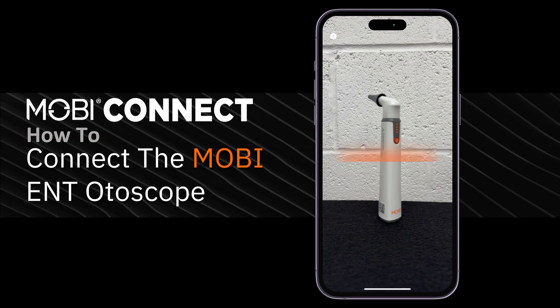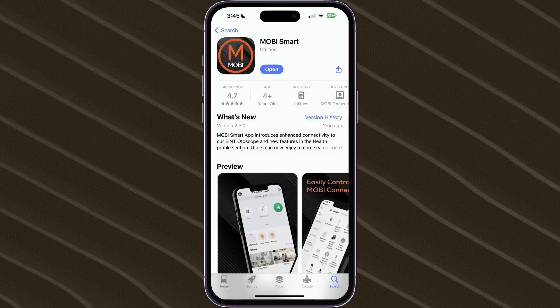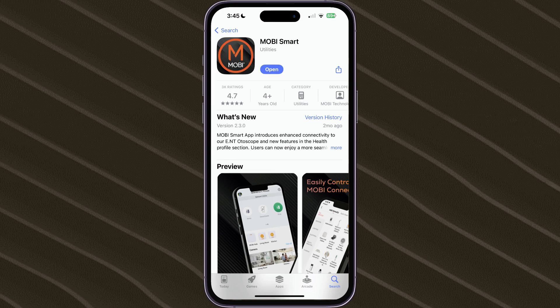Hello, in this video I will demonstrate how to connect the Mobi ENT Otoscope. To begin, please download the Mobi Smart app and sign up for an account.